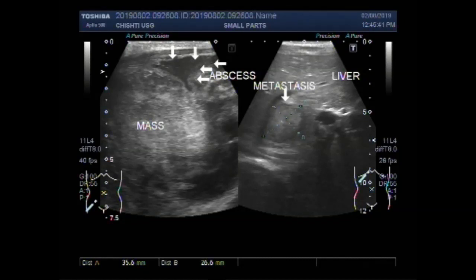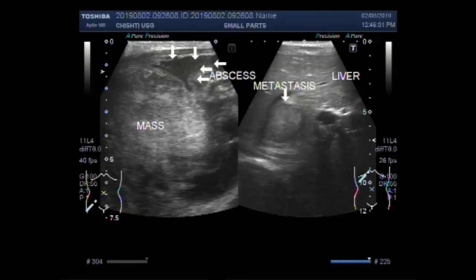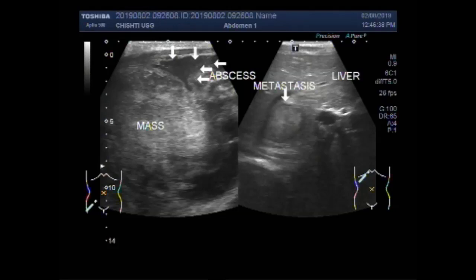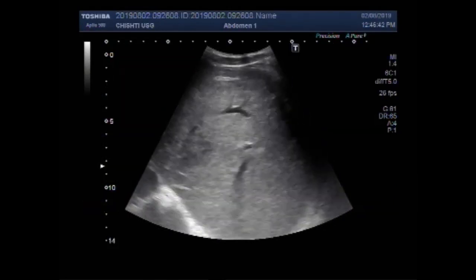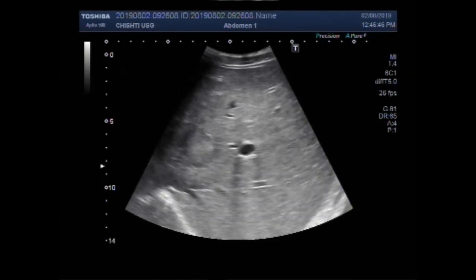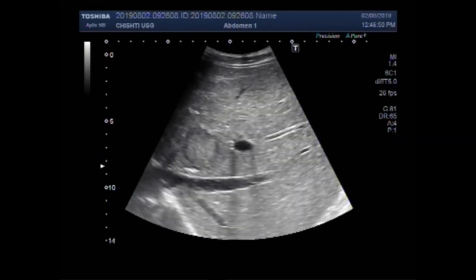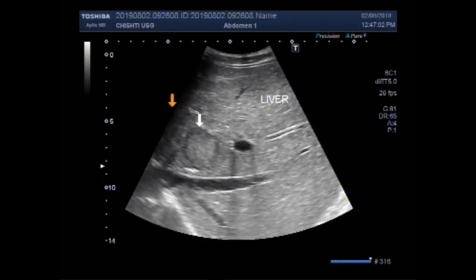Now you can see another video showing this metastasis with a convex probe. You are going to see the scanning of the metastasis — this hepatic mass — with the convex probe. You can see this bull's-eye shaped mass, which is a metastasis in the middle portion of the left lobe of the liver. This is metastasis.